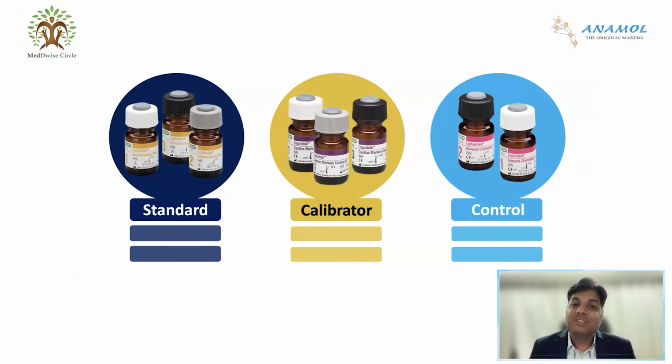Friends, when we talk about standard, the standard is a liquid in which the value of analyte is fixed. It has one single constant value. And the standard is usually a synthetic material. It is prepared in a laboratory.